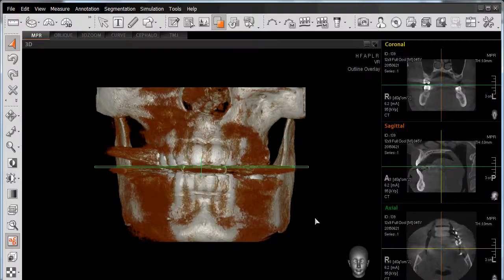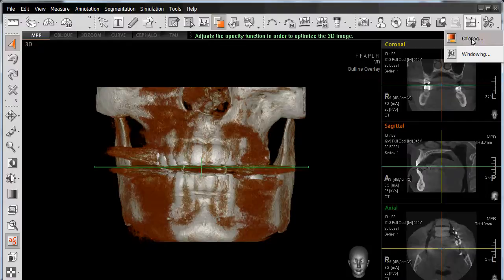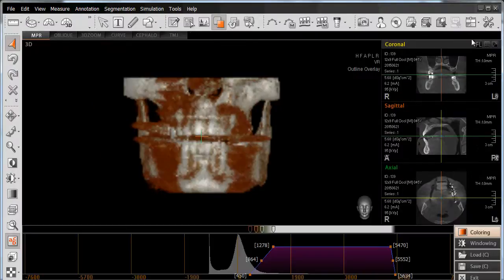When opening a 3D scan for the first time, it's not uncommon for the soft tissue to superimpose the hard tissue. What we're going to perform is a fine-tune to segment out our soft tissue. To perform this, we'll navigate the mouse to our fine-tuning icon, left-click, and then left-click again on Coloring.